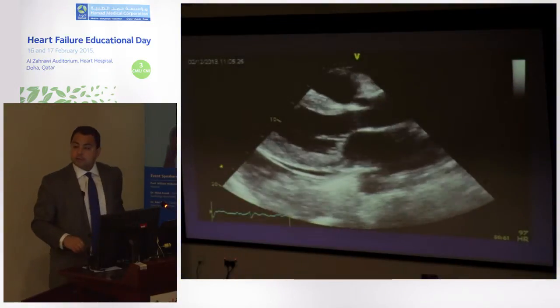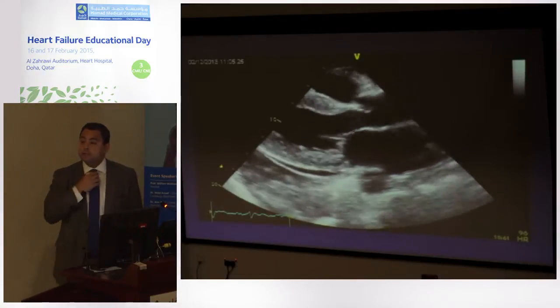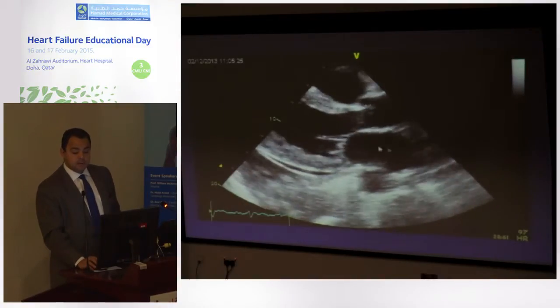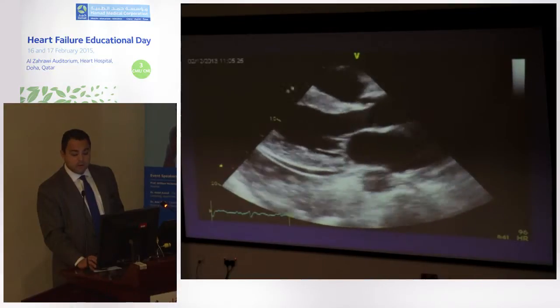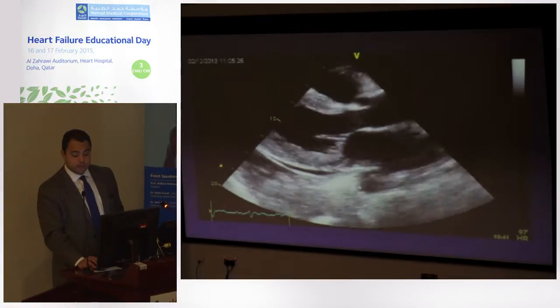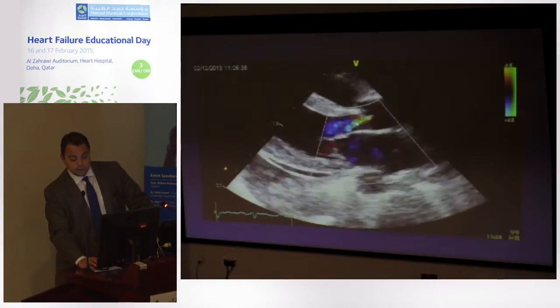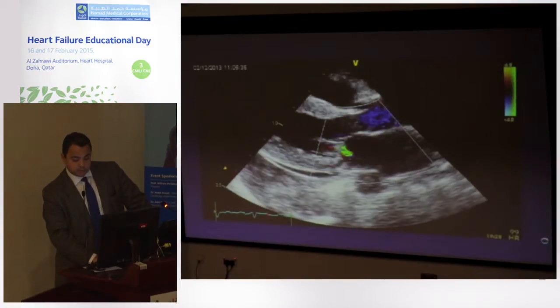So this is his transthoracic echocardiogram. This is a parasternal long axis view. So what do you see here? Yeah, so his EF is down. But remember, don't forget the RV. The parasternal views are excellent for the RV. He also has a lot of LV hypertrophy, okay, and a big atrium. And there's a small pericardial effusion here. Okay, he's got mild aortic insufficiency here. He's got some mitral regurgitation here. We need to assess more images.